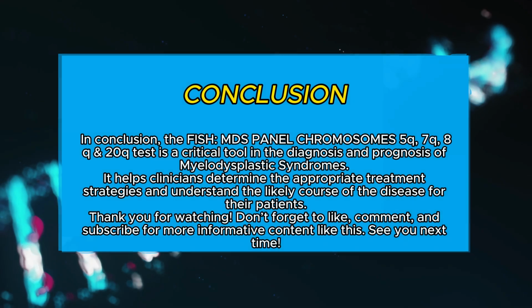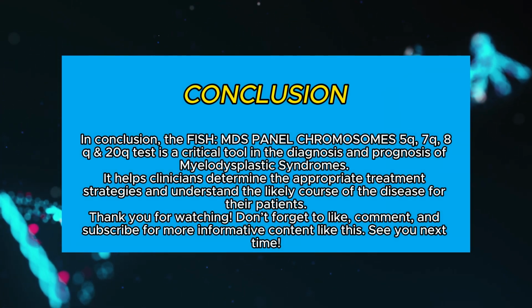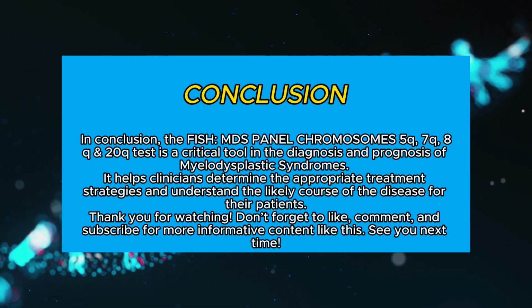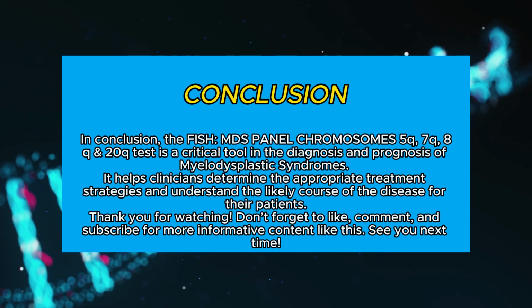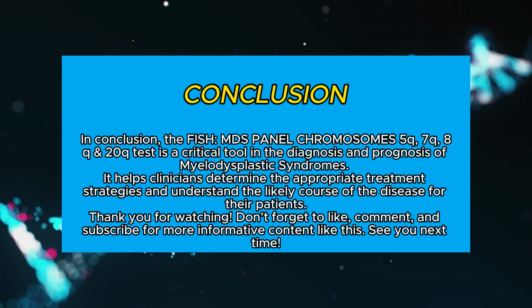Conclusion. In conclusion, the FISH MDS panel chromosomes 5q, 7q, 8q, and 20q test is a critical tool in the diagnosis and prognosis of myelodysplastic syndromes. It helps clinicians determine the appropriate treatment strategies and understand the likely course of the disease for their patients.